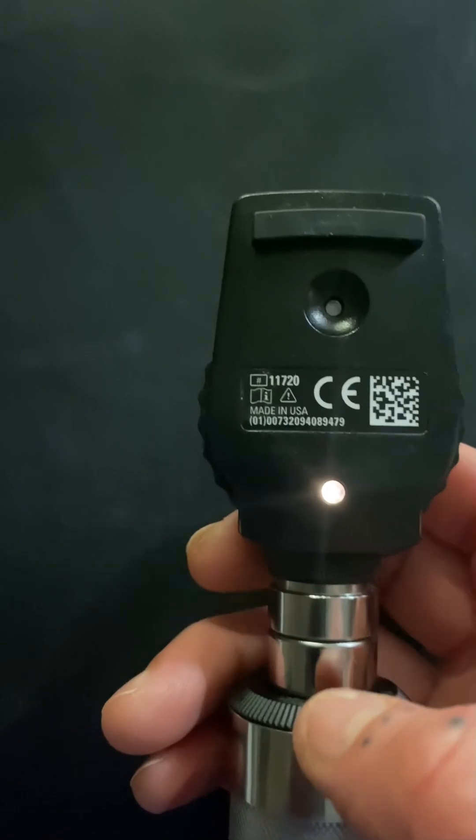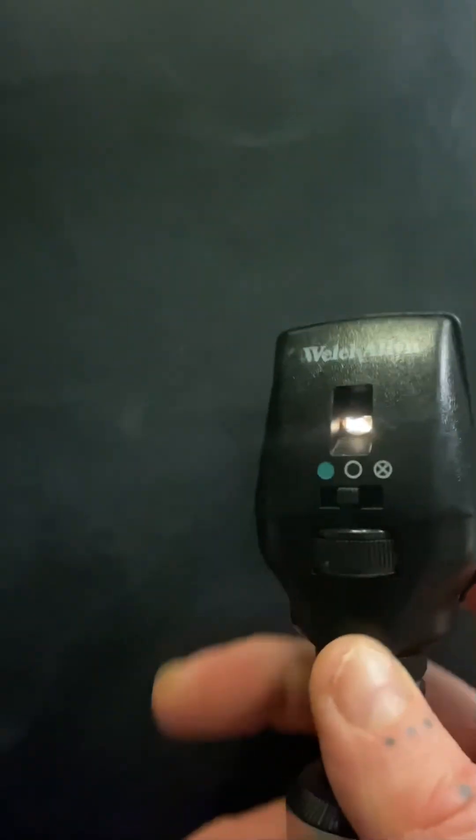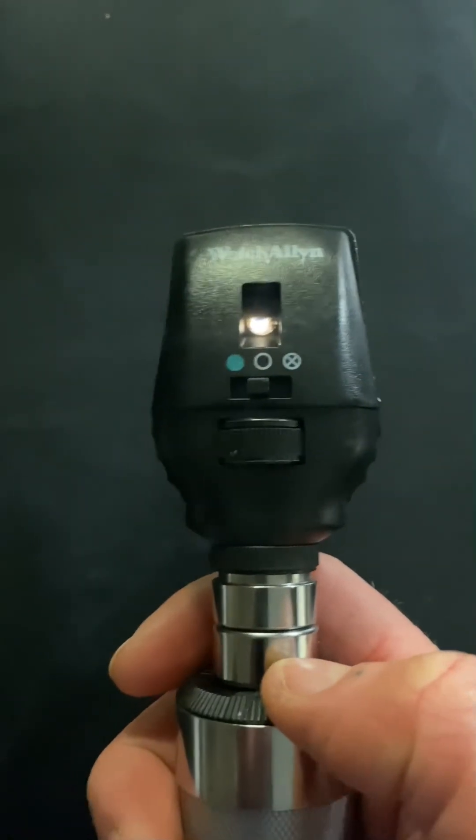There's also a slit setting, and on some other ophthalmoscopes there is another setting that's a green light, though we don't have that one in this model. Those are the basic features of the ophthalmoscope, why they are there, and what they're used for. I hope that gives you a little bit more insight.